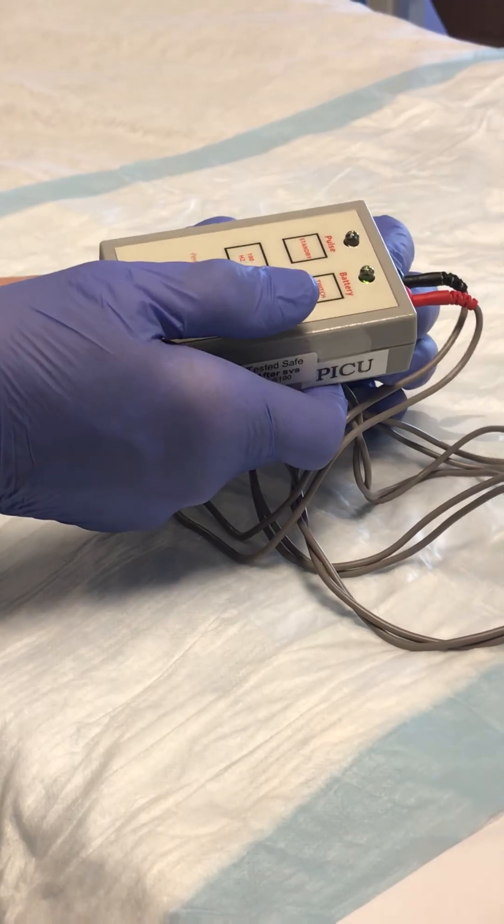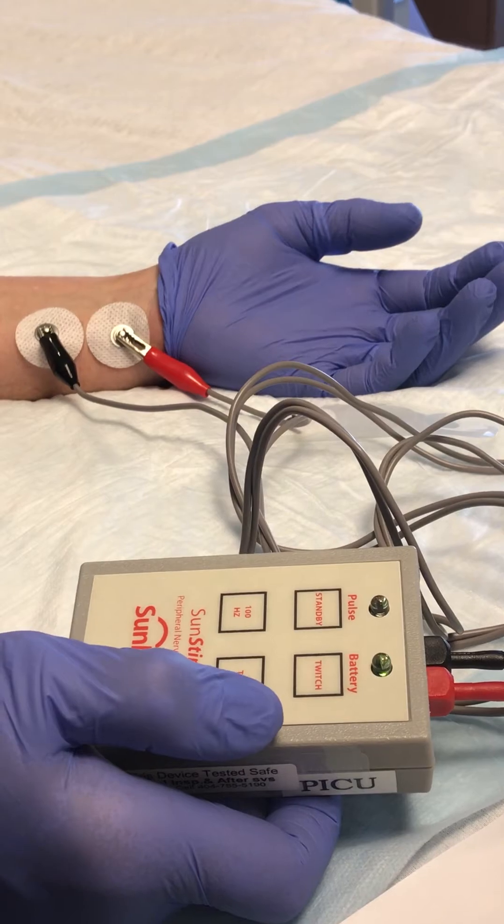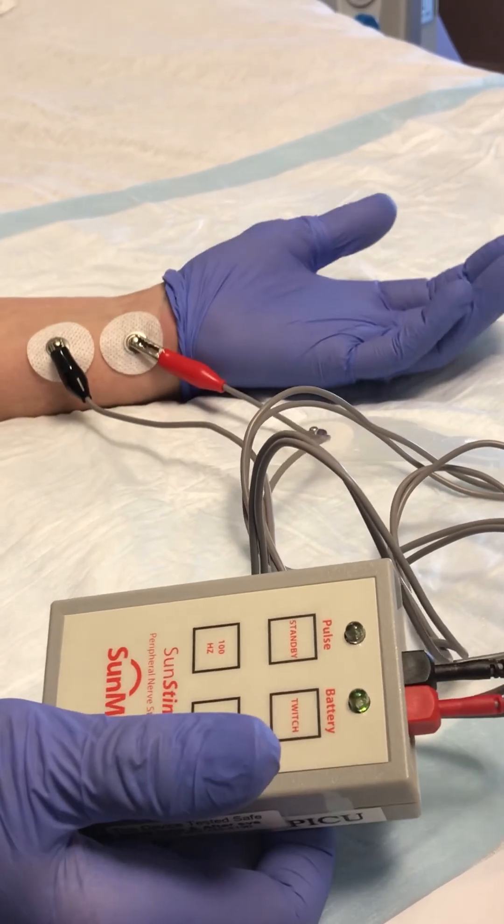That was only three, so we're going to turn it up again. We're up to five now. We have five and that's how you elicit a train of four.